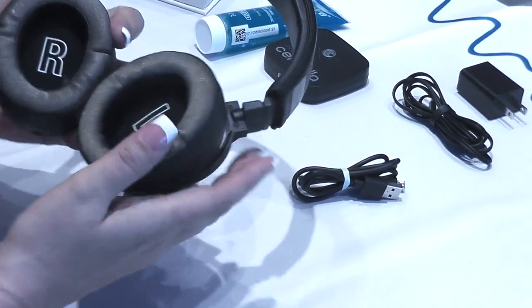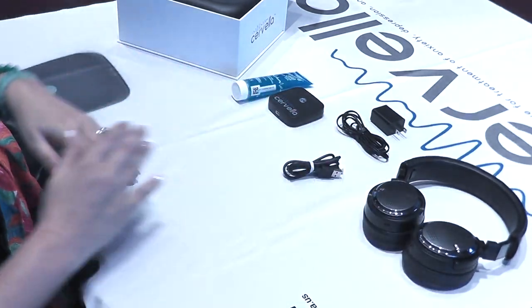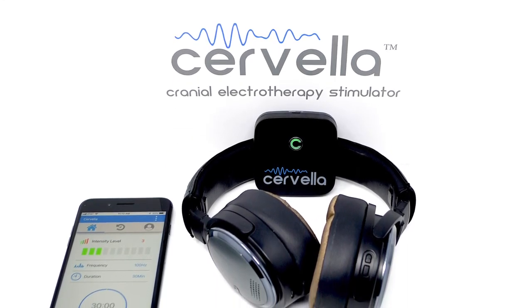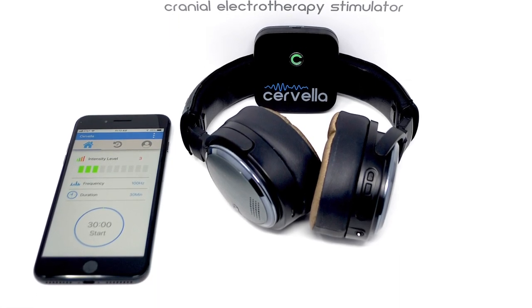The headset also features an active noise cancellation system so you can use the Cervella in high noise environments such as an airplane, bus, or office. Note that the headset also has a built-in rechargeable battery, so don't forget about charging the headset prior to use.